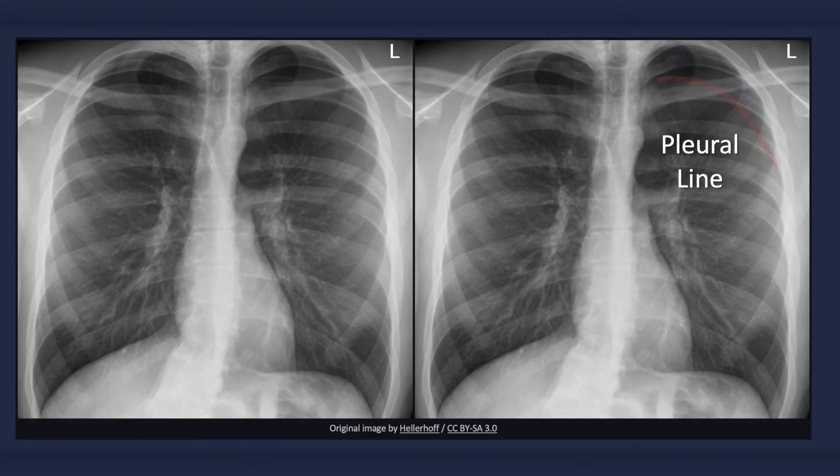A very helpful sign of a pneumothorax is the demarcation of the visceral pleura on the x-ray, which is identified by a thin, sharp white line. This fine hairline opacity occurs between the lateral border of the lung and the free air in the pleural space.